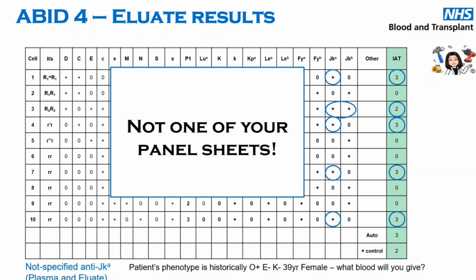Someone saying there, if it was C3D positive but IgG negative, it generally tends to be, if it's IgG positive, you would do an eluate, but you may just be wanting to double check that there's something there. But if it's C3D positive, the patient just might have a cold autoantibody, so it would just be the call of whoever was doing that investigation.